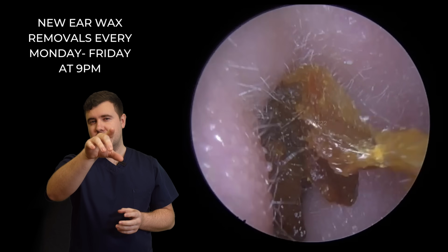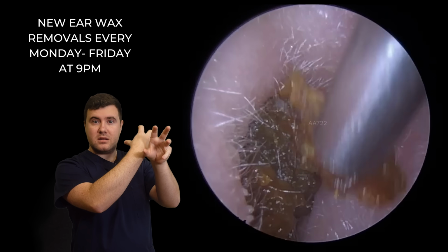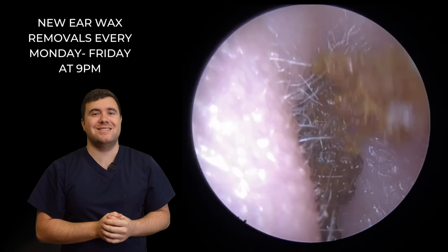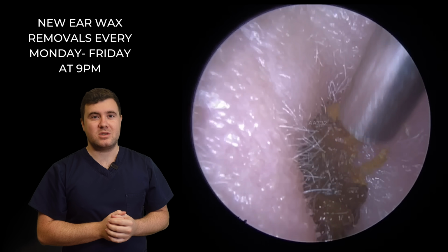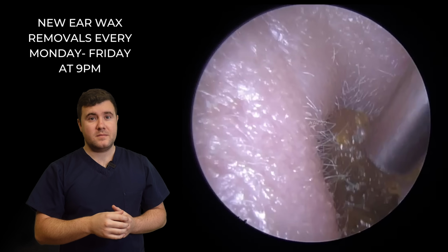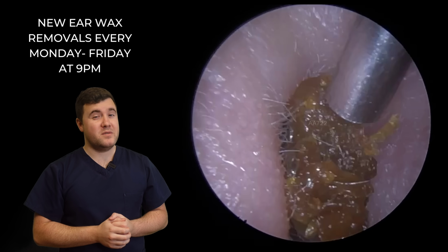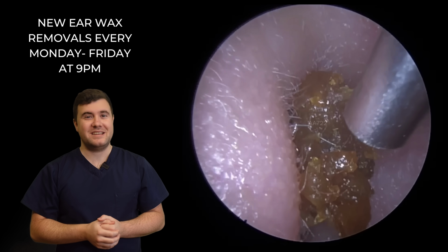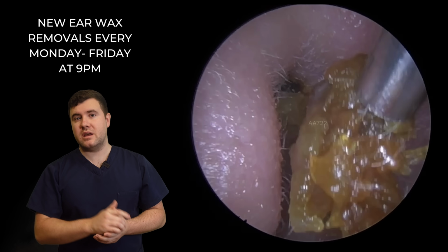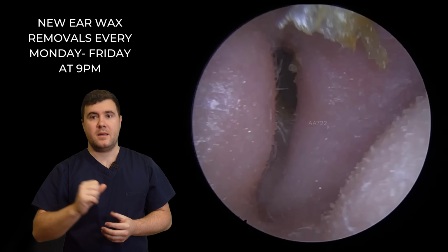So again, I'm going straight for that little smaller bit because I'm trying to suction that little tail into the suction to get a good grip. Get some good leverage on there. So there we go, you can see that all just go into the tube, and this is going to start pulling this from behind as well. So we are going to have a very similar issue with this side. So it's just holding on by some dead skin again. There you go, you can just see it just behind that wax plug, that long tail of dead skin again.